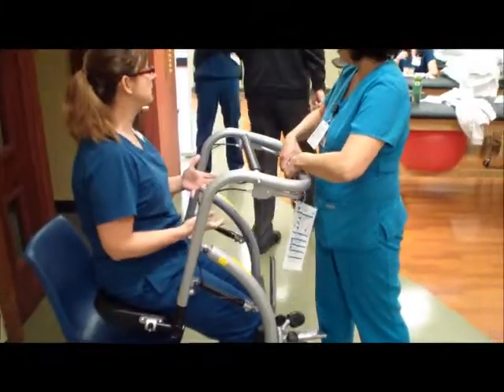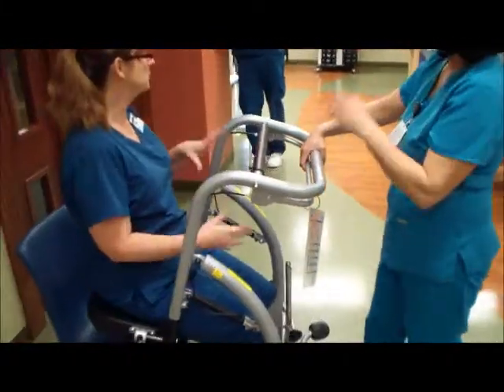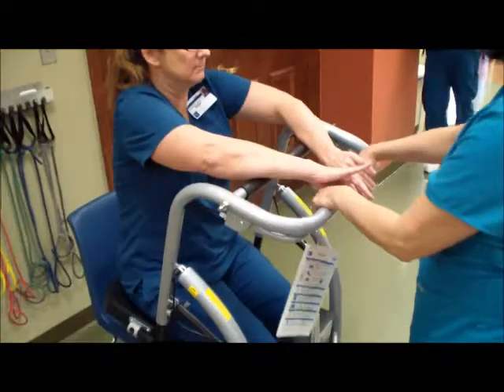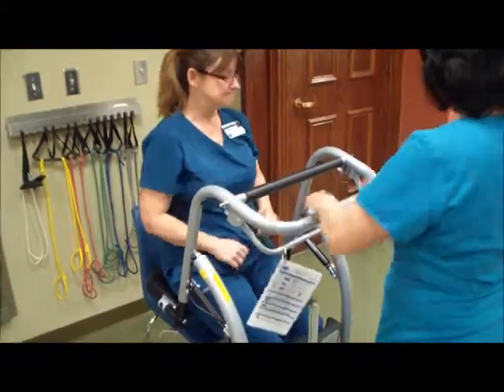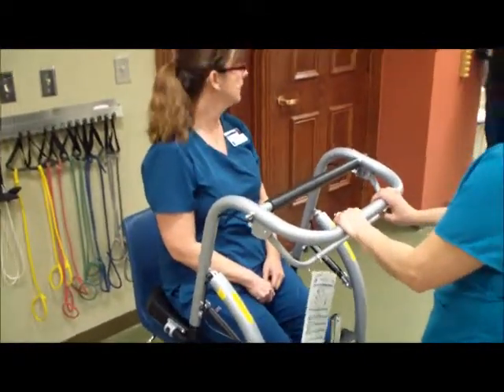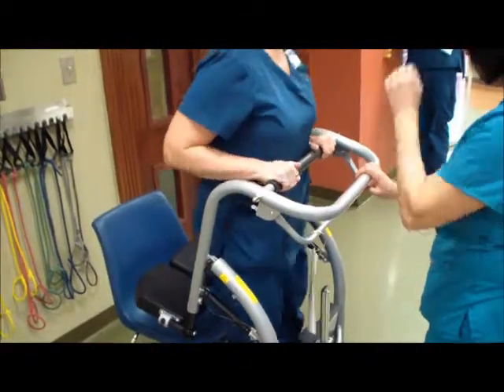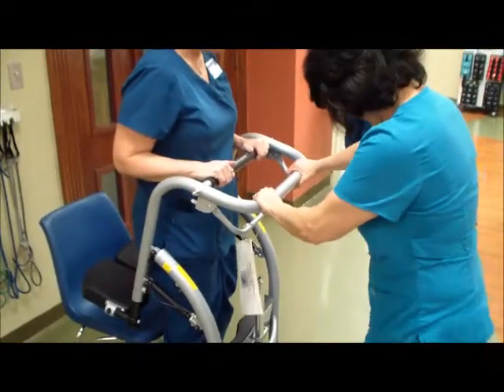So before you're getting somebody up, if you look at it and go, ooh, that angle's really off, just sit yourself in it so you can weight it. And then I can do it myself by holding on to it if I'm sitting on it. Is that as low as it goes? Pretty much. Okay, so I'm feeling pretty good. Anna could unlock me, and then I could go walk around.